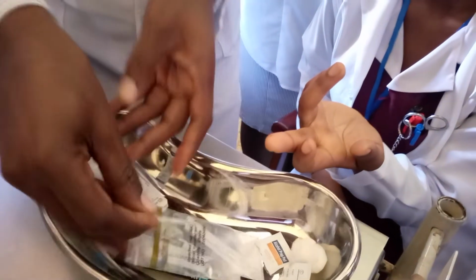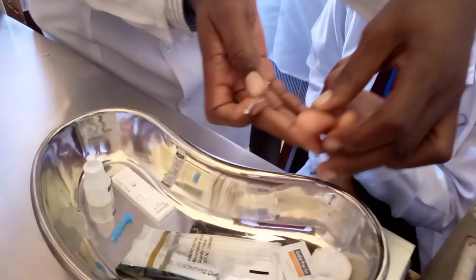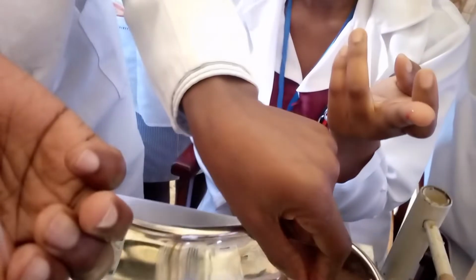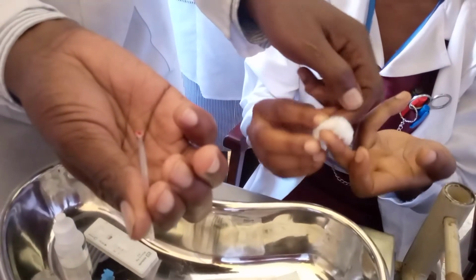Okay, so when you get the cup, there's this part here where we're supposed to scoop the blood. So you go like this. Can you just turn? Okay, then do that so that you have enough blood. Then put it there. So the cup is full, as you can see. Then you give the patient dry cotton wool to put there.